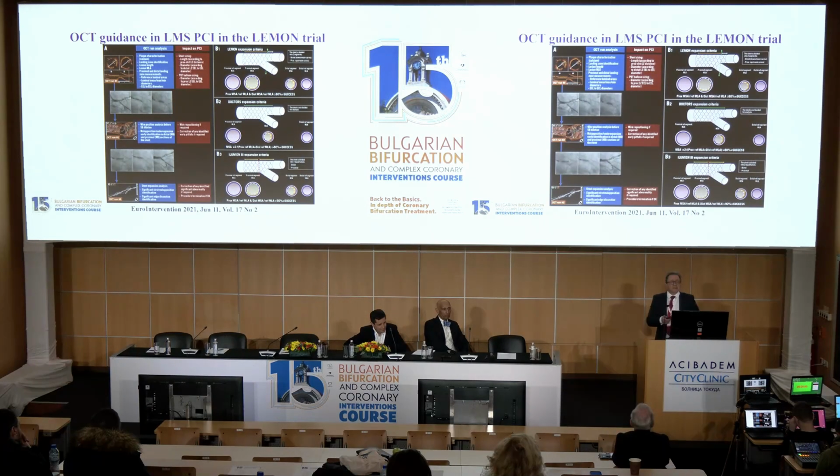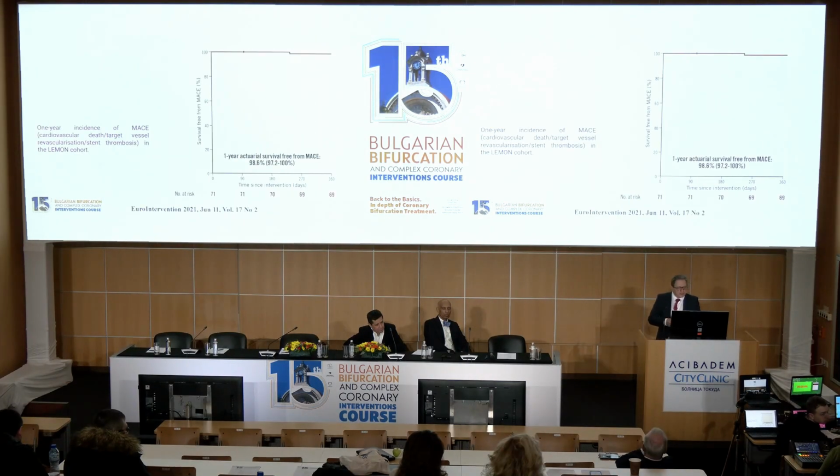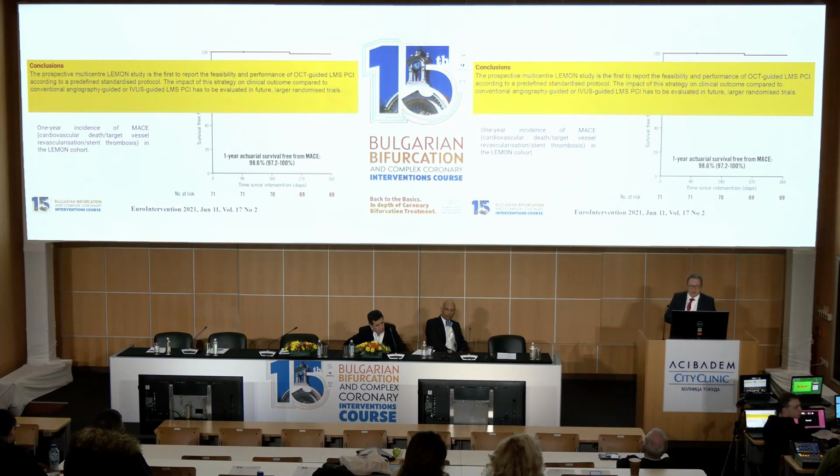operator. But since I would say 10 years, the number of papers, trials, studies trying to use OCT guidance for left main disease treatment is increasing. Here you can appreciate, let's say, a Lemon trial, which was the first trial showing the possibility of usage or utilization of the OCT for left main.